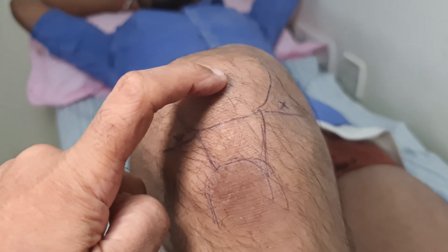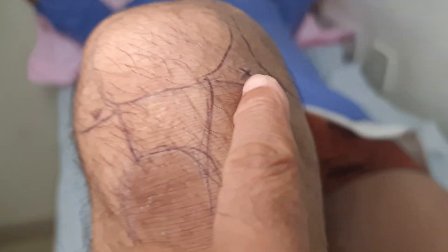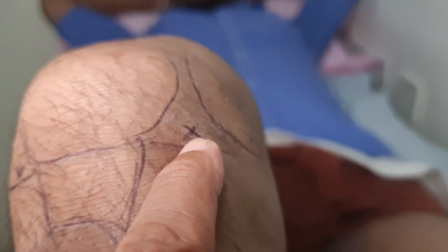This is the knee cap, this is the leg bone, and this is the joint line. This is the entry point we have marked, and we will get into it and put PRP into it.